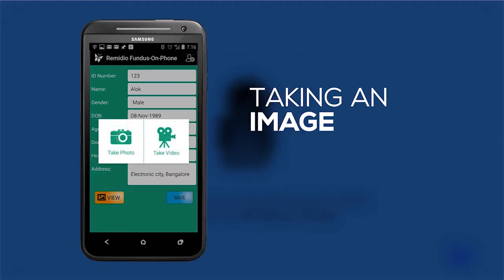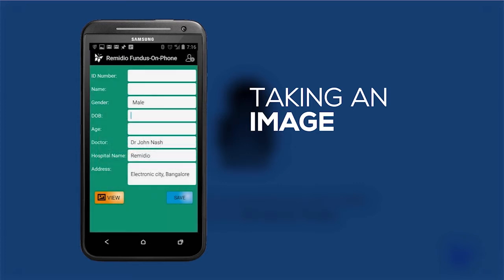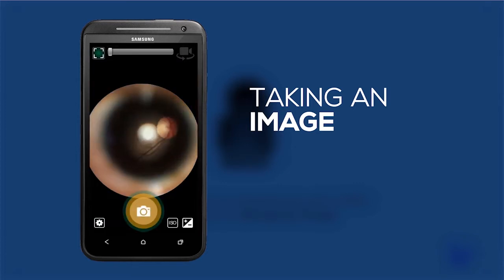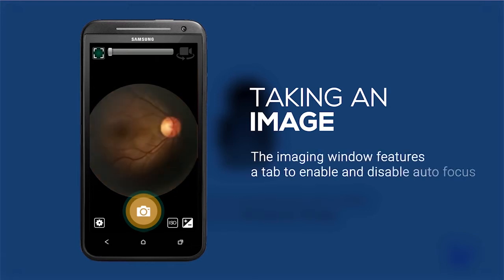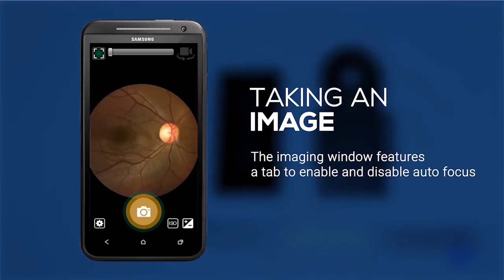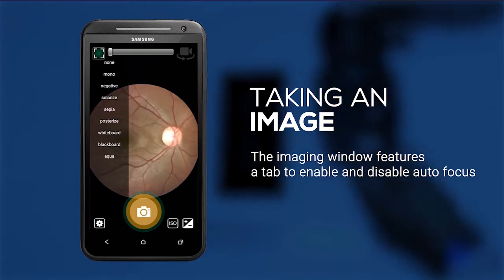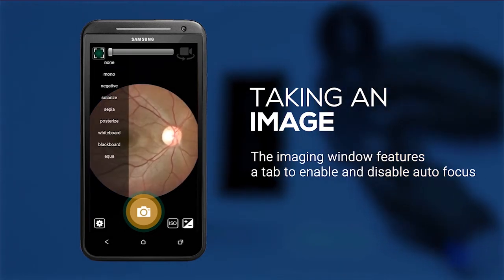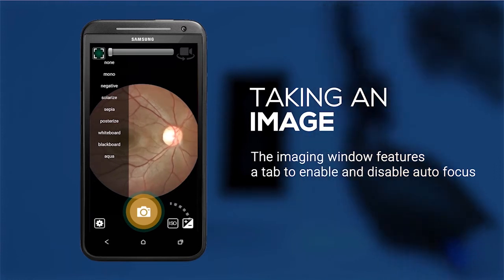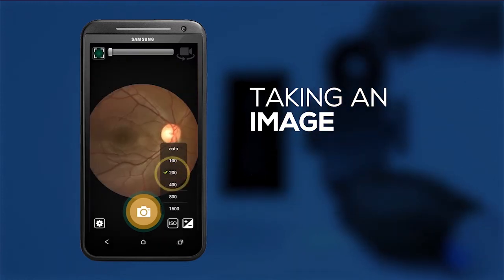Choose between Still Camera Mode or Video Mode. The application is now ready for imaging. The image window features a tab to enable and disable autofocus, a settings tab for camera modes, and a tab to set ISO and exposure values.